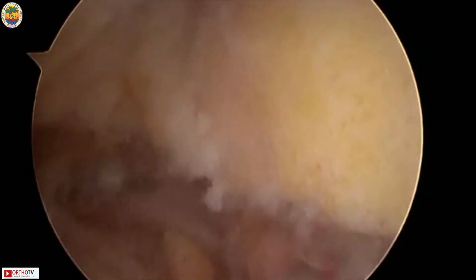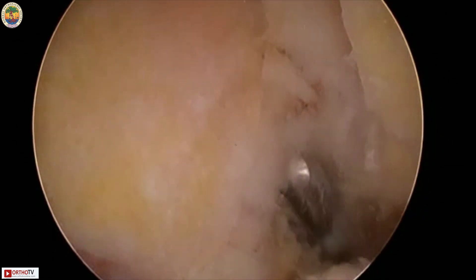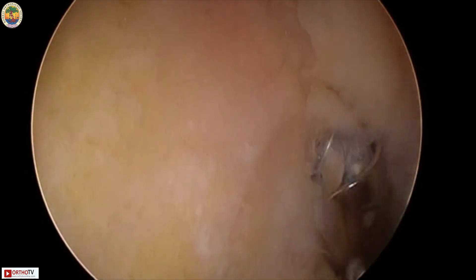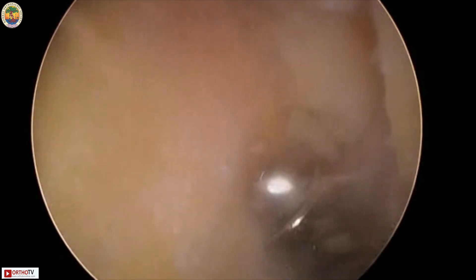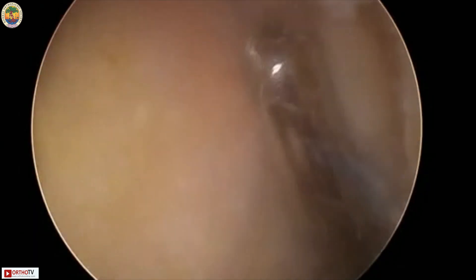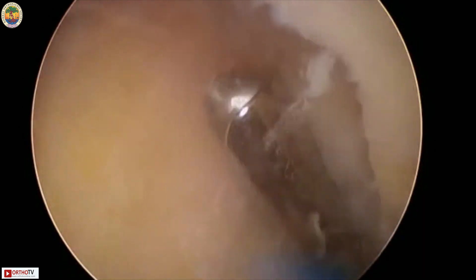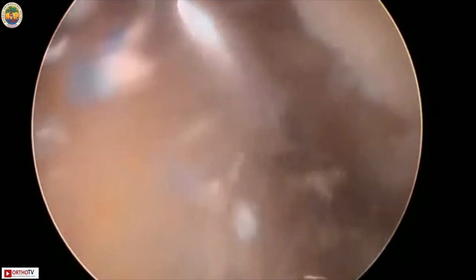We look at the superior part of the AC joint and the superior AC capsule. We do retain the superior capsule of the AC joint; however, you have to visualize and resect the superior part of the AC joint, again starting anteriorly and then going towards posterior. We resect a little bone from both sides to achieve adequate space between the AC joint superiorly as well. Failure to resect the superior part of the AC joint may also lead to failure of the procedure.